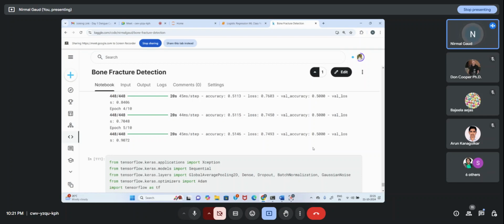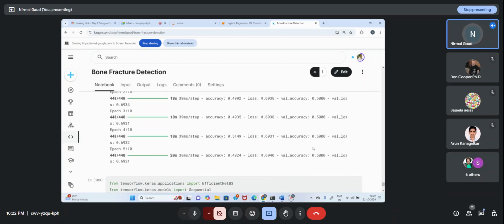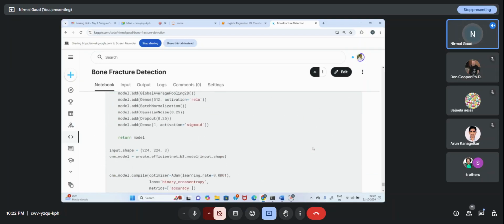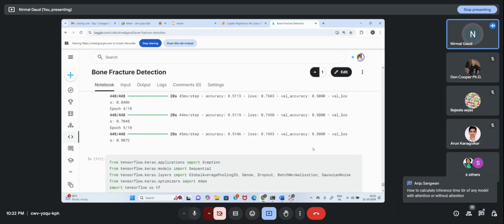तो ऐसा नहीं है कि सर आप हमें सीधा सीधा बता दोगे कोड और ये कह दोगे कि हाँ भाई, देखो प्रोजेक्ट इज ओवर, you will show us the code directly. नहीं, ऐसा नहीं है. I also tried a lot of architectures here, where so far you have seen the issues which I faced. The four architectures which I showed you so far, in every architecture I failed.